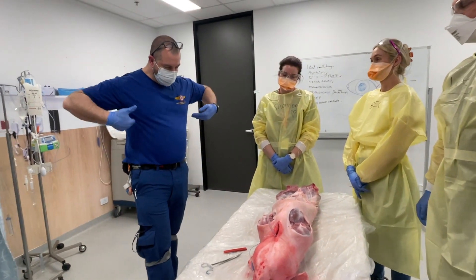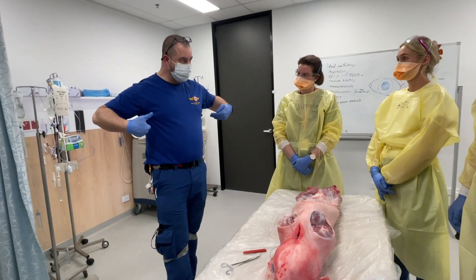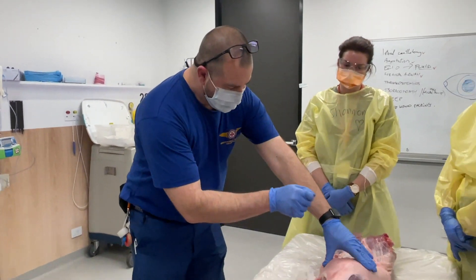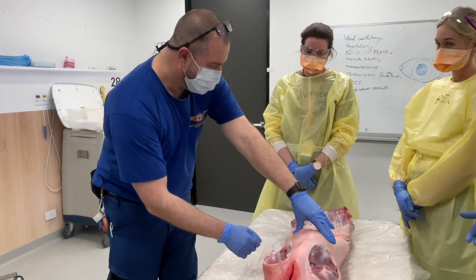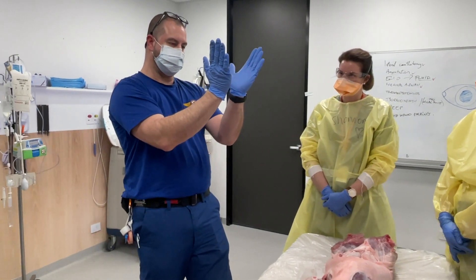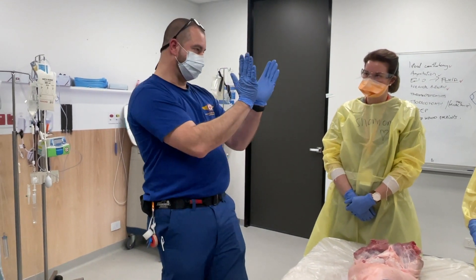So we're going to do our fourth intercostal space and fourth intercostal space only, mid-axillary line. We're going to identify that. We're going to do a four to five centimetre incision. And remember, as you go through skin, it'll be a larger incision as you dissect down to the muscles — it'll be a conical shape type straw structure.